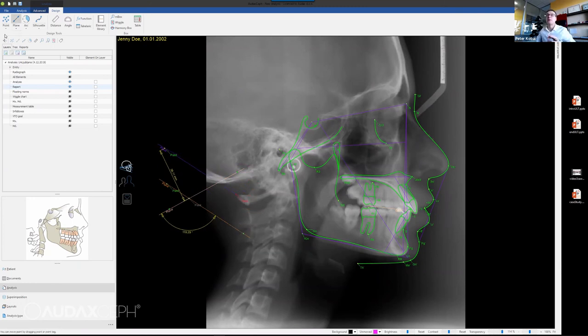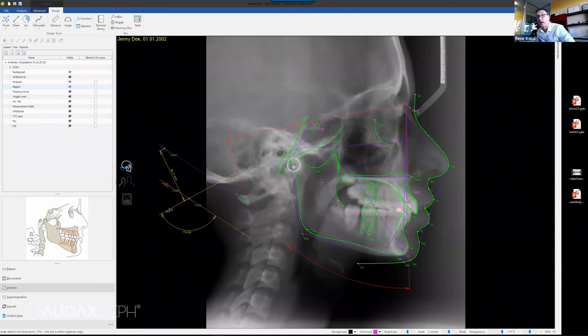then they move. For example, if I have one point, the second point, the third point, I name this one Sella, this one would be Nasion, and this one would be A. If I place A point to this position, then I place this too close to Nasion, and I place this one here. This will be the angle SNA. And what I need to do is just to grab all those measurements, the right ones, and put them on the paper. And that's exactly how AudaxCeph works.